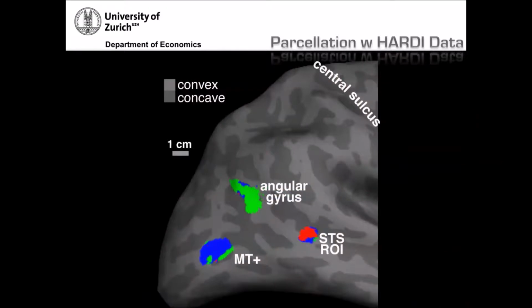So the end game of that paper was just a proof of principle idea that if you scan somebody twice and use the first data set to train a support vector machine classifier, and then you classify the second data set, then you can get, I think it was up to close to 90% accurate classification.